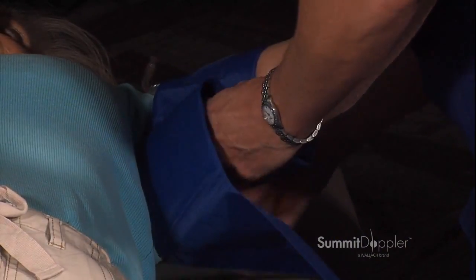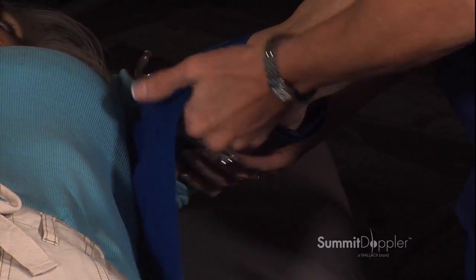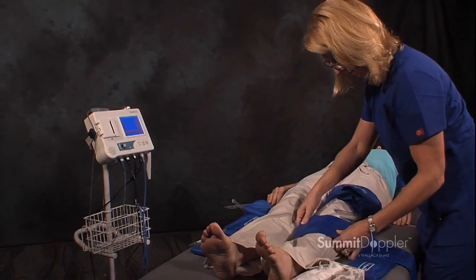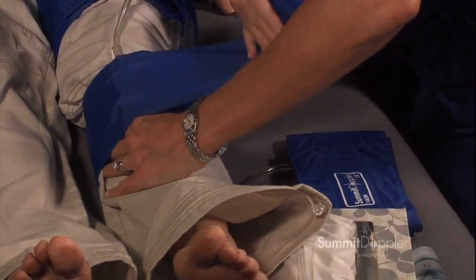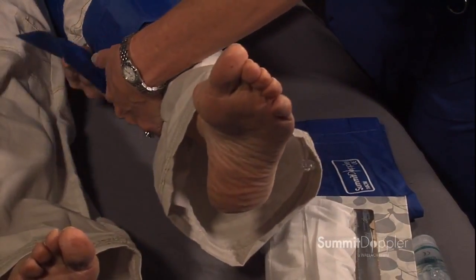Ensure cuffs are not so tight they restrict blood flow and interfere with the test. Also verify cuffs are not so loose that they produce inaccurate pressures. It is important to place each cuff in the proper location. If the cuff is too high, it may result in false high pressure readings. If it is too low, the cuff may obstruct the Doppler's ability to locate the artery.